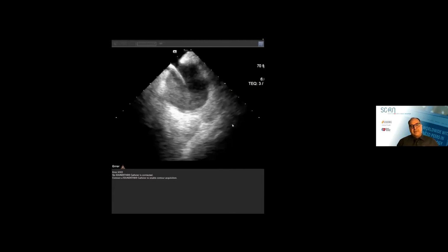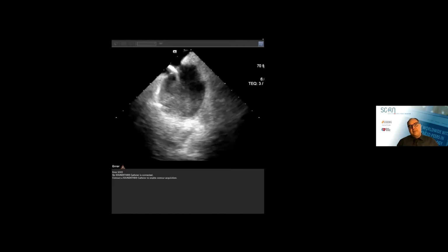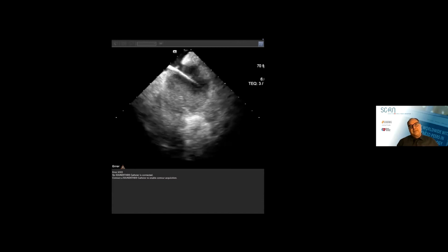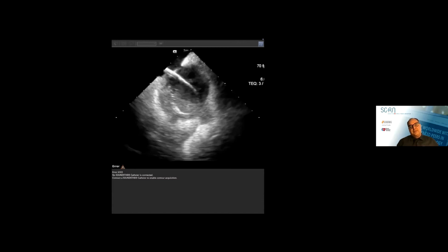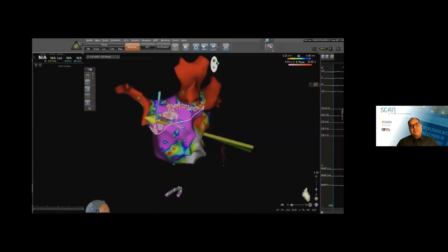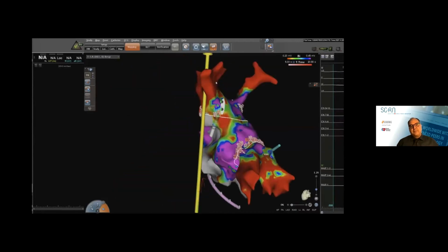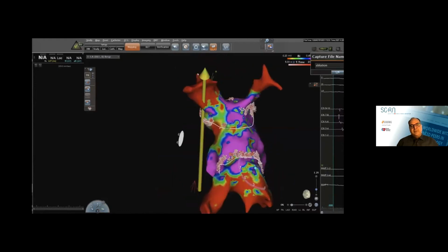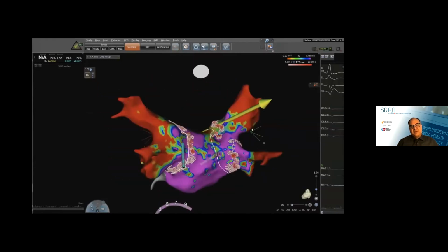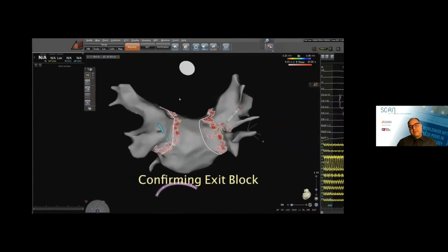So what we can do in those cases is deflect the sheath and create this sort of U-shaped form in the left atrium. And this will direct the tip of the ablation catheter directly towards the right veins. And doing this, we will have no problem achieving contact for any point on the right side. And I believe with the new catheter, the number of magnets has increased, so that will give us more power in terms of control over the direction of the catheter.